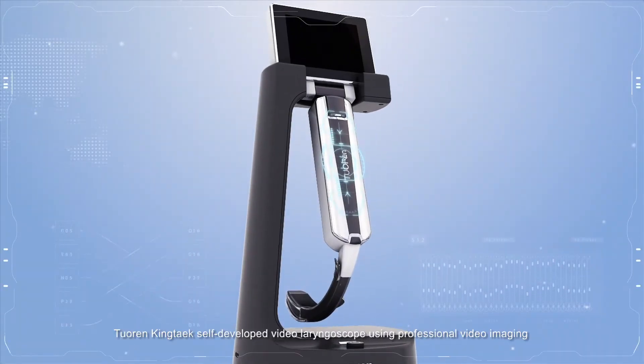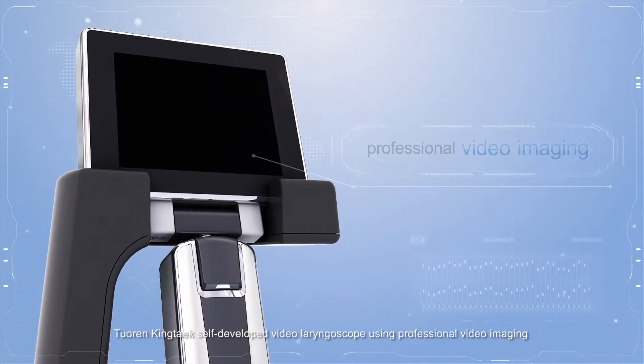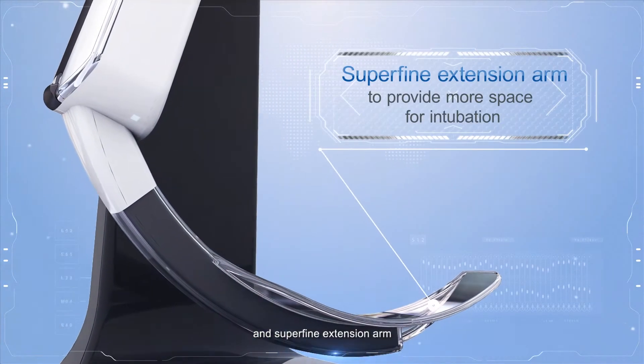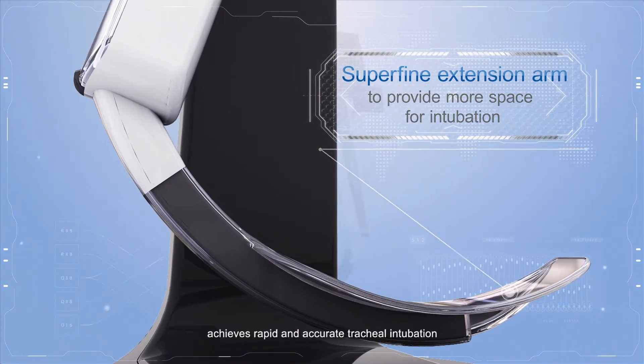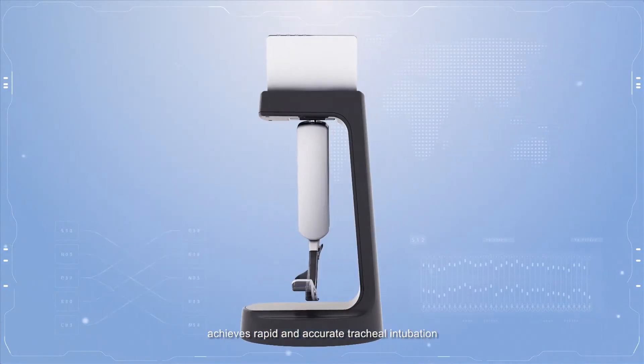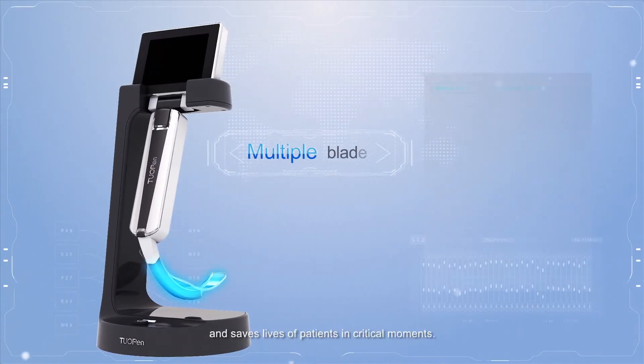Tuoren Kingtaek self-developed video laryngoscope uses professional video imaging and a superfine extension arm to achieve rapid and accurate tracheal intubation, saving lives of patients in critical moments.